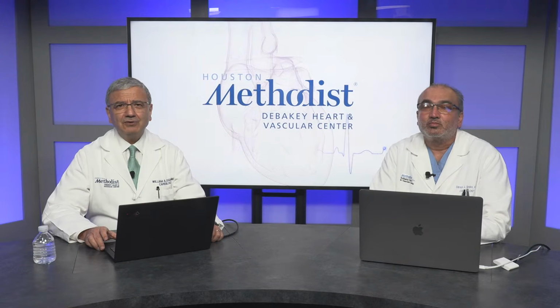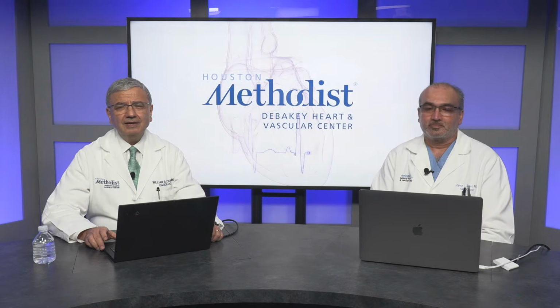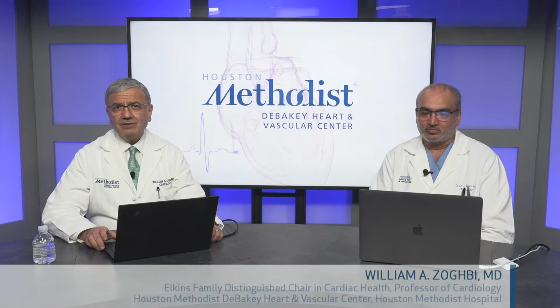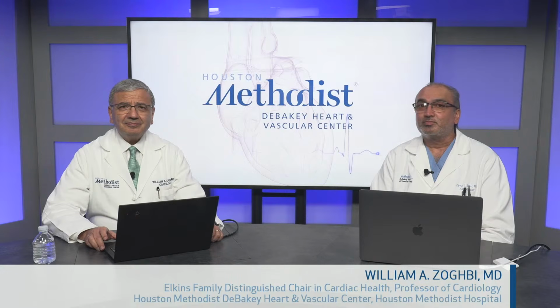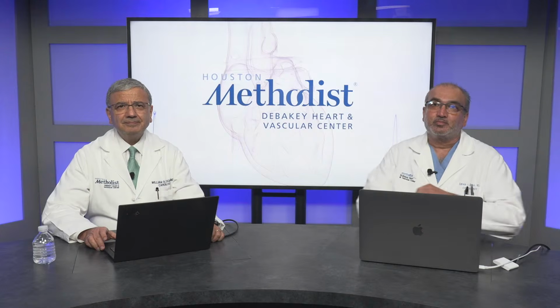Today is a very special topic. Hopefully you will enjoy the interaction and the knowledge that you will glean from all various areas of cardiovascular imaging, from echocardiography and Doppler to MRI and CT. And with me here in the studio is Dr. Dipan Shah, who is director of our cardiovascular imaging program as well as cardiac MRI, and will be also joined by Dr. Min Chang, who is the associate director of cardiac CT here at Houston Methodist.